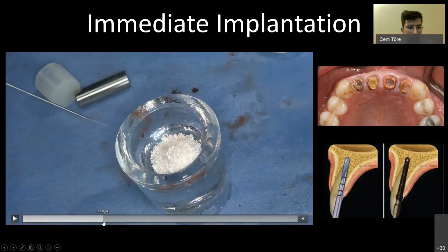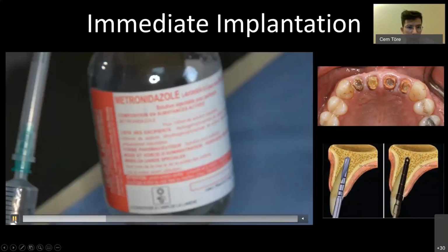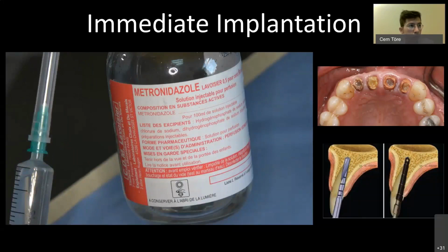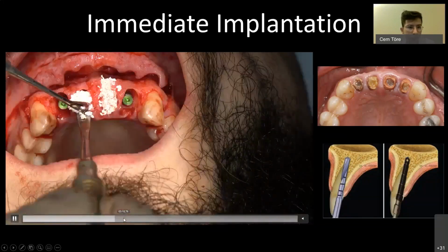This is something that can be applied for any graft you use. We mix whatever graft we use with metronidazole, be it solely xenografts or a mixture of xenografts and autogenous bone. We mix it with an antibiotic solution to ensure we have no infections later on.